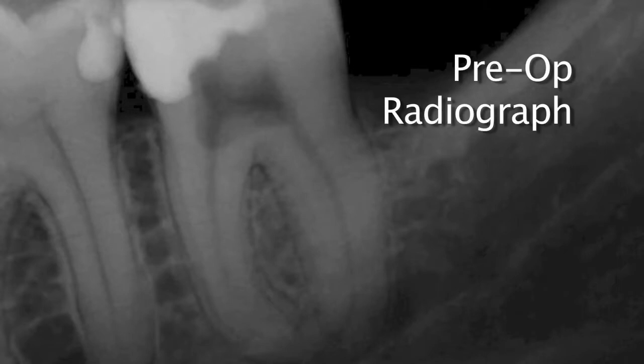Let's take a look at the pre-op radiograph. The pulpal diagnosis was previously initiated therapy, and the periapical diagnosis was symptomatic apical periodontitis.